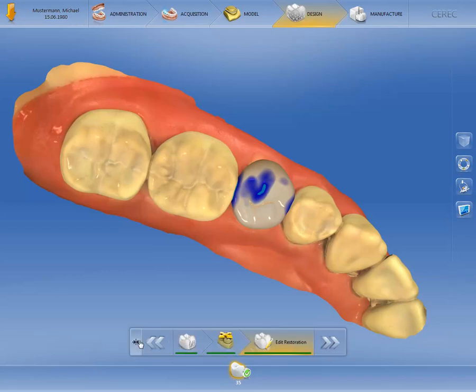We can now access the restoration parameters for the current single tooth restoration. Parameters set here are local restoration parameters, which only apply to this specific case and do not influence the global parameters.